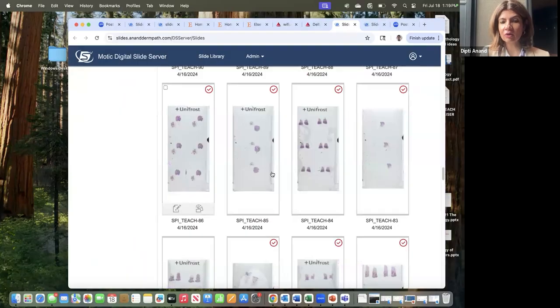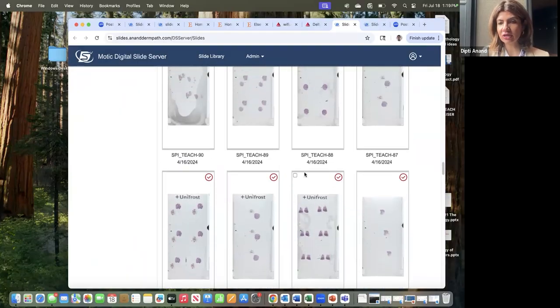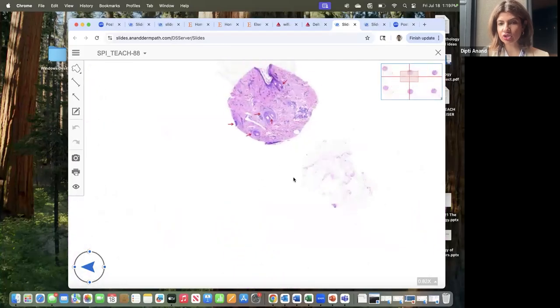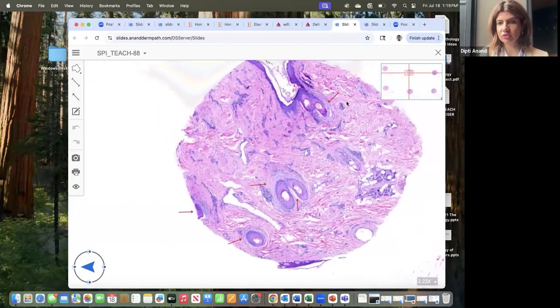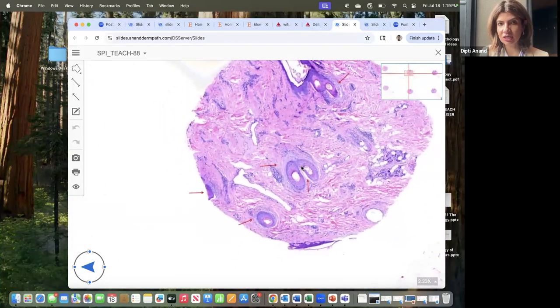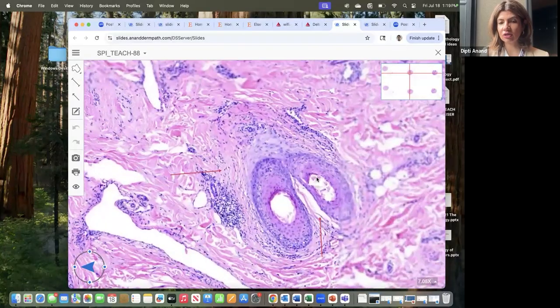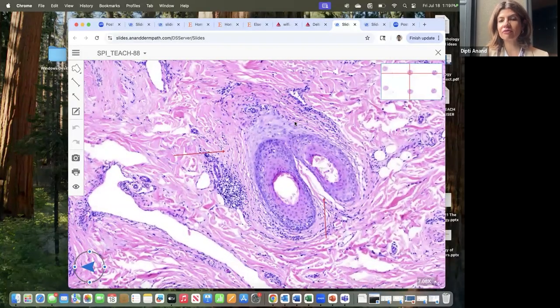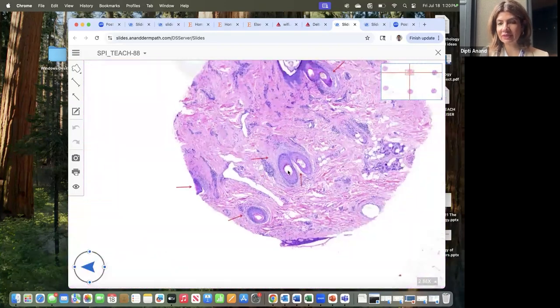Okay. Now, this is going to be in contrast to your lichen planopilaris, wherein you again have the scarring alopecia, because it's a round section, you don't see sebaceous glands, so it's a scarring alopecia. But you notice that around the hair follicles, instead of perifollicular inflammation, you have this perifollicular fibrosis. Do you see that? The fibrosis is more prominent than the inflammation.